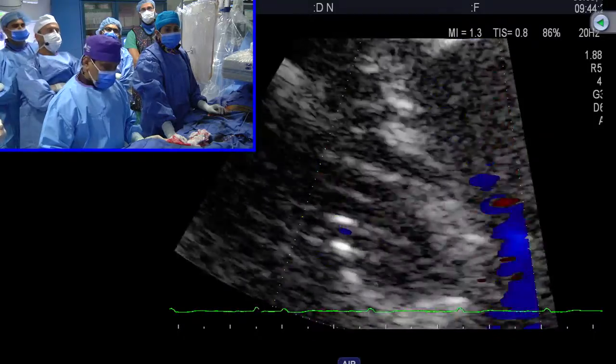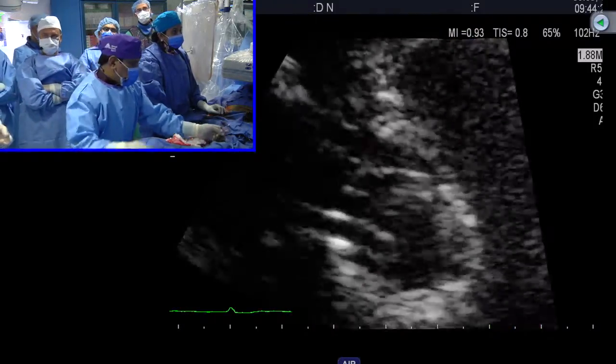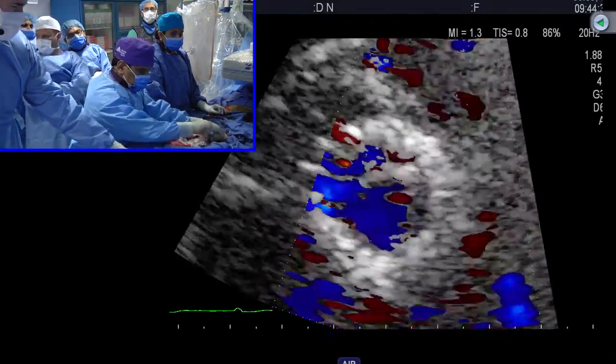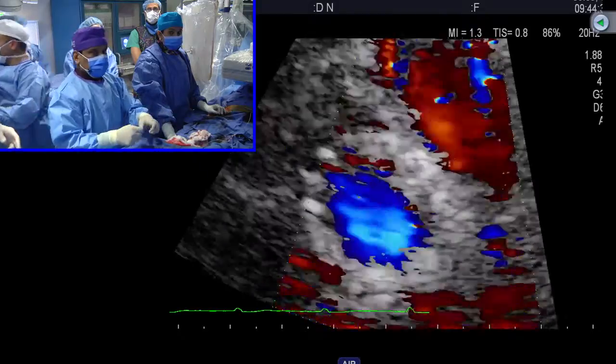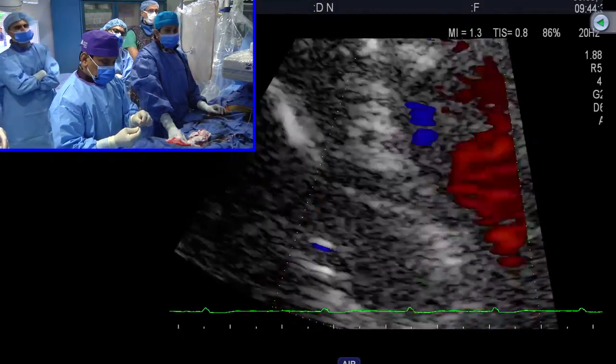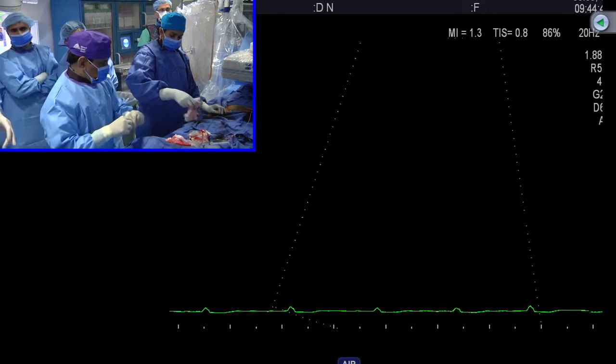We haven't gone further with the dilatation. Diastolic was 50, now we are in the 60s. Yeah. Good. We'll cross now, then we'll show the hemodynamics. I'll be back after I finish my pericardiectomy. I'm talking about echo-wise, I think it's an optimal result. Okay, good.